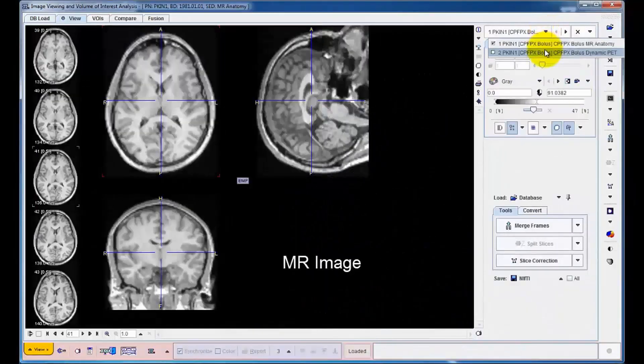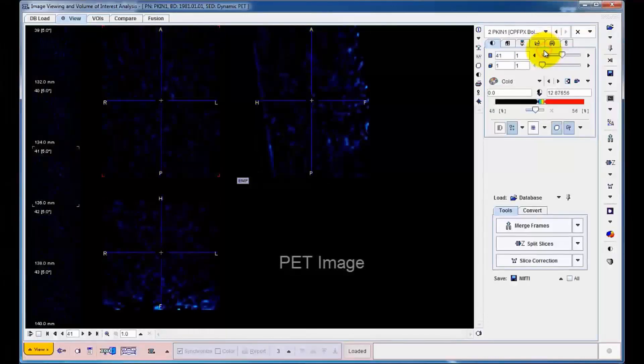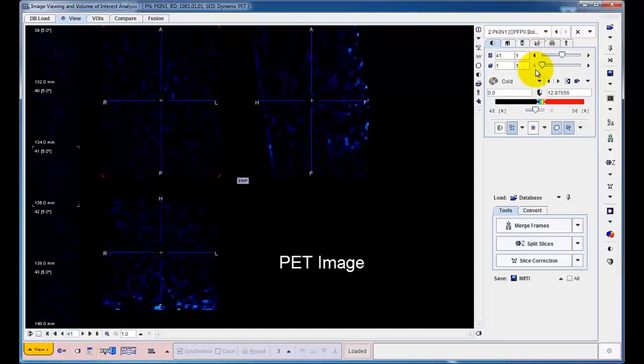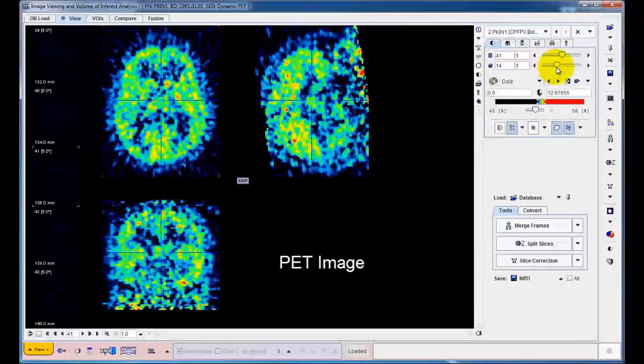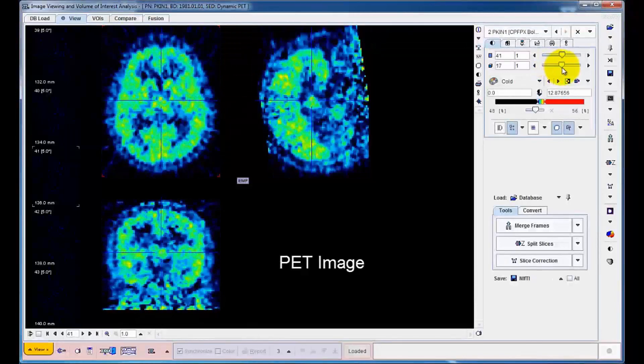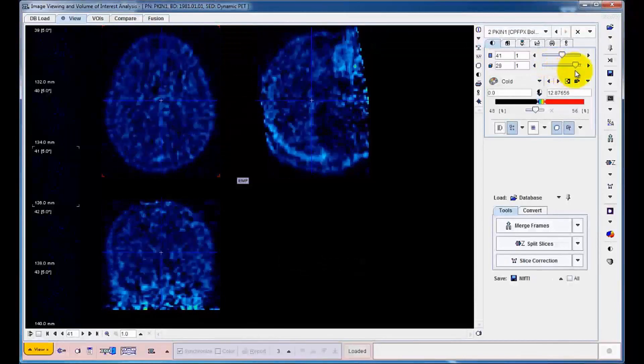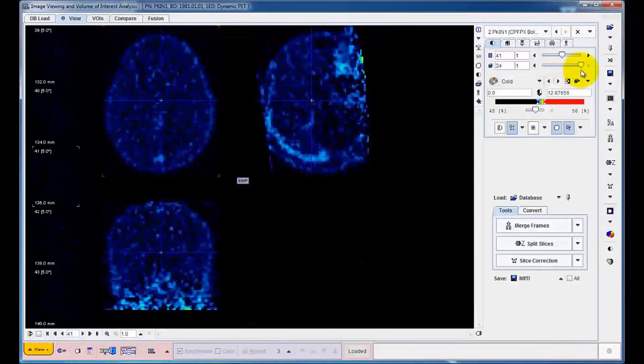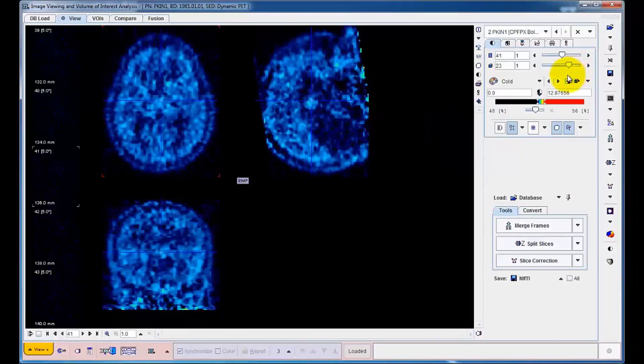The images are available for display in a stacked arrangement. The MR is shown with a grey color table, while the PET uses one of the color tables routinely applied in nuclear medicine. The images can be displayed in various ways.